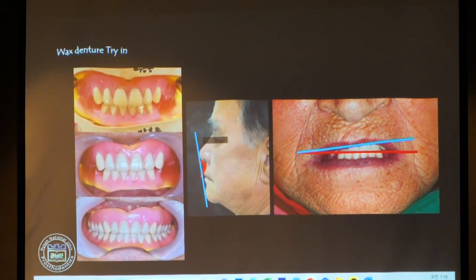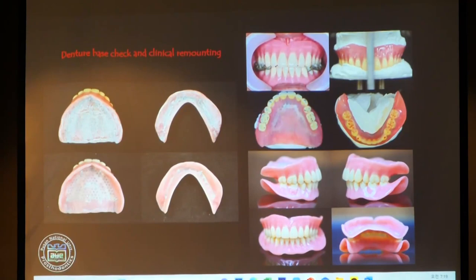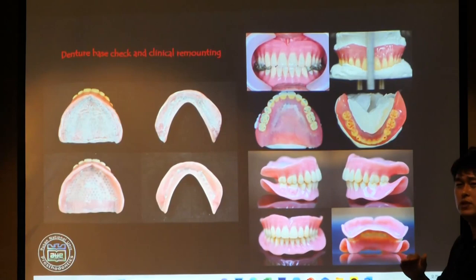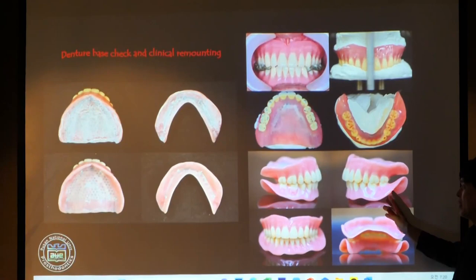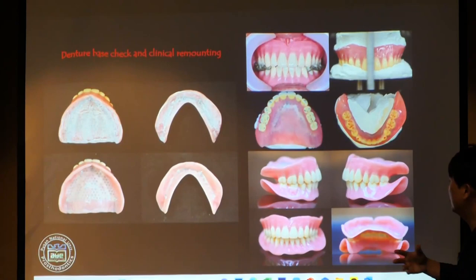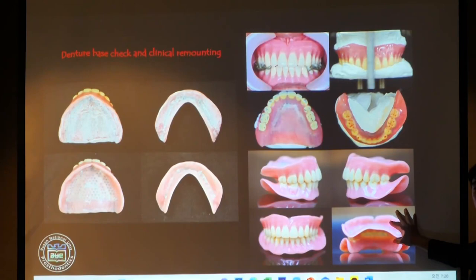And then flasking, checking the inner surface, adjusting the occlusion one more time, and then finishing the denture. Anyway, in Korea, to get government insurance, the patient has to visit 5 times to make full dentures. I know the insurance system is different from our country, but our country is almost free if the patient visits 5 times. I want to skip one step, but in that case, I cannot get insurance from the government. So it's a real dilemma. But I know America has a different situation, right? So you can skip the procedure very easily.